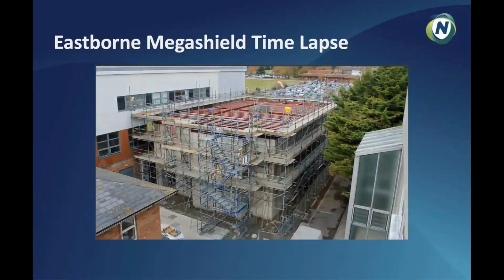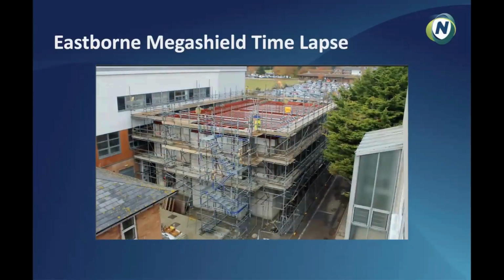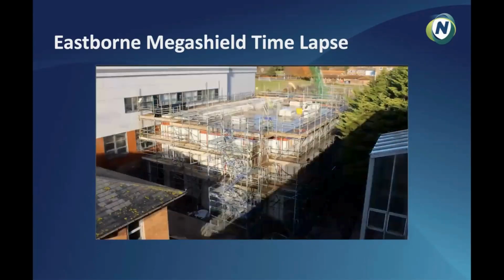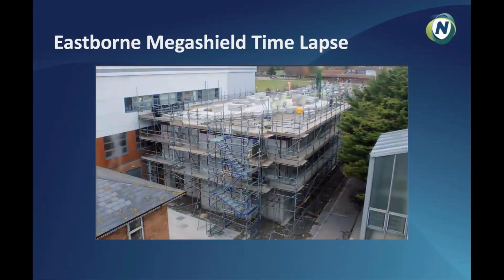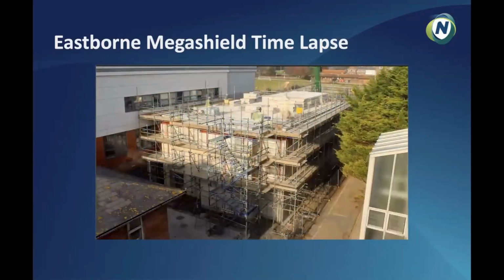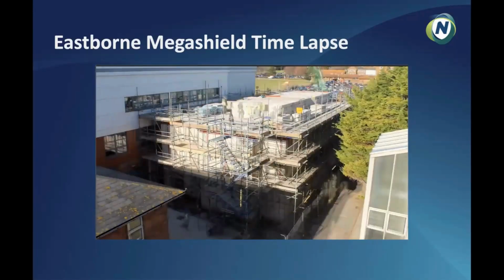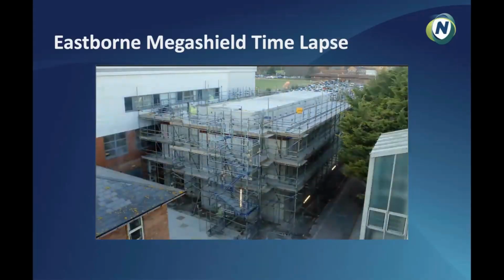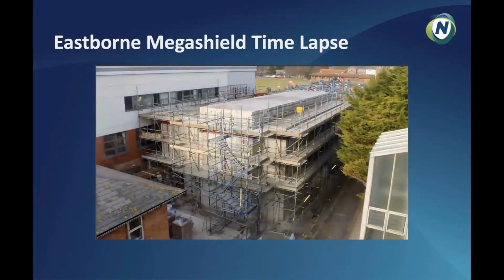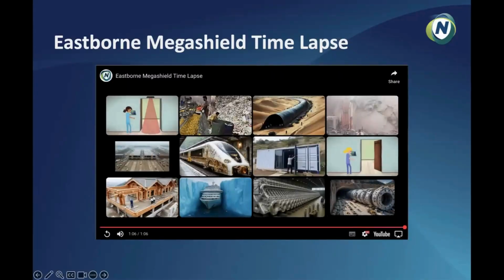Now, depending on the physics that you've done, you can obviously have a plant room or offices above this space, and the shielding will vary depending on the usage and the occupancy rates above the bunker, but it just gives you full flexibility to do what you need to do. And there we have it.